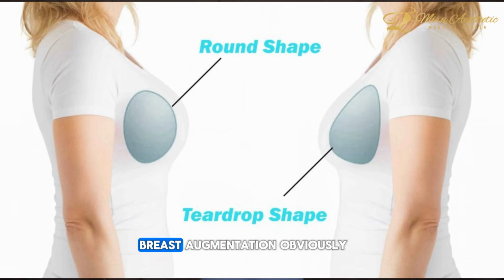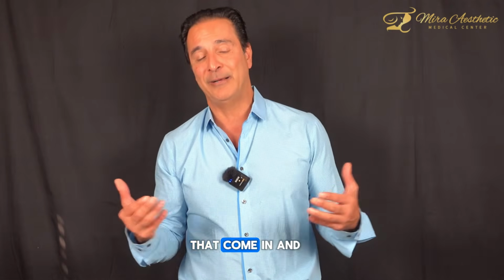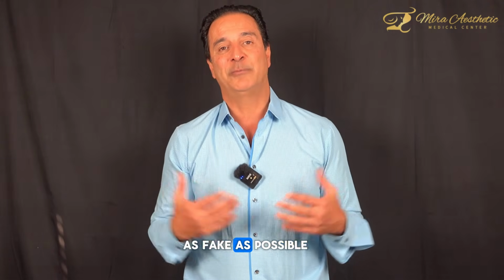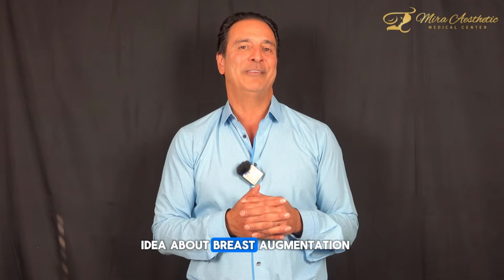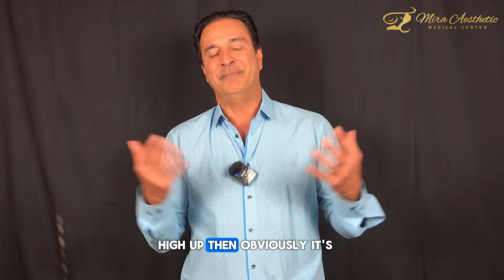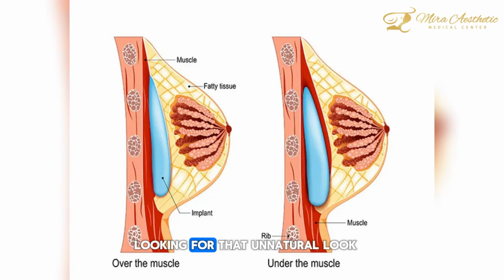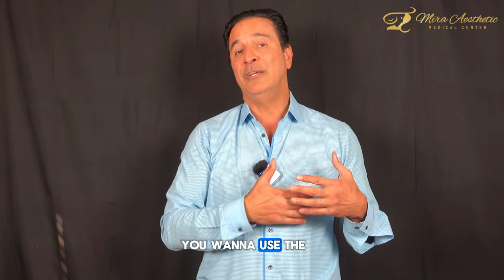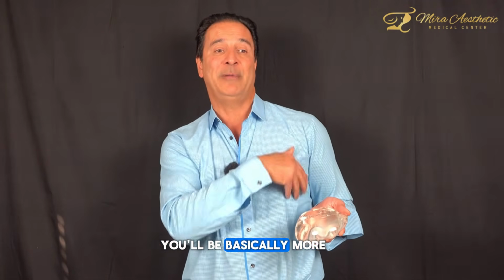Obviously, there are patients that come in and ask, oh, I want to be as fake as possible. Now, I don't advocate that. I think the whole idea of breast augmentation is that people should be guessing, hey, does she have an implant or doesn't she? If you have it high up, then obviously it's a dead giveaway that you have an implant. So if you are looking for that unnatural look, you want to use the 50-50 rule, or even the other way around, the 60-40 rule, so you'd be basically more top heavy.